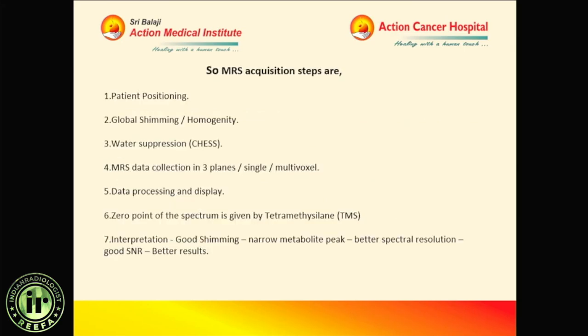So the MRS acquisition steps are patient positioning, global shimming, then we apply water suppression, then MRS data collection is done, data is processed and displayed, and if we are plotting a graph, there has to be a zero point. So the zero point of the spectrum is given by tetramethylsilane or TMS, and data interpretation is done.